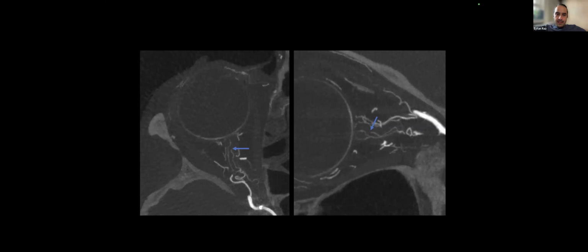Okay, so first question. Again, I wanted to remark that this level of analysis I got to later. During the case, I acquired the imaging, but I didn't look at it in detail. But you can argue it's the same with an M1 occlusion. You see reconstitution from the ACA, but you still reopen the vessel. And here the patient is suffering, so these collaterals may not be as effective. But I don't know about that. We don't have a correlate of perfusion imaging. The clinical exam here is what we're using as a decision metric.